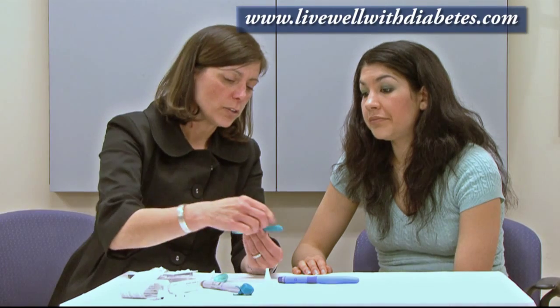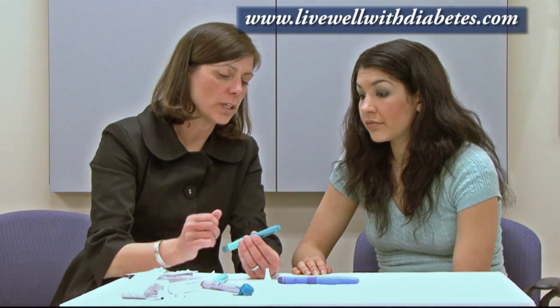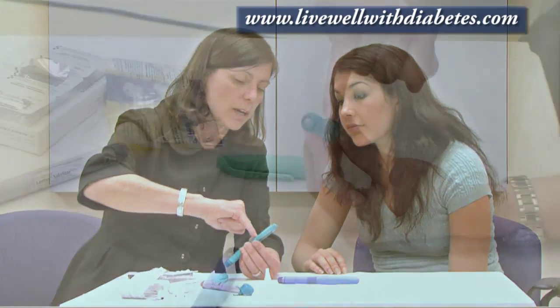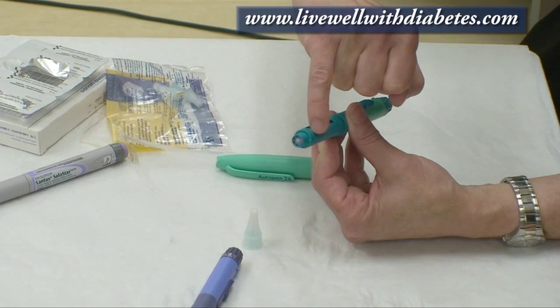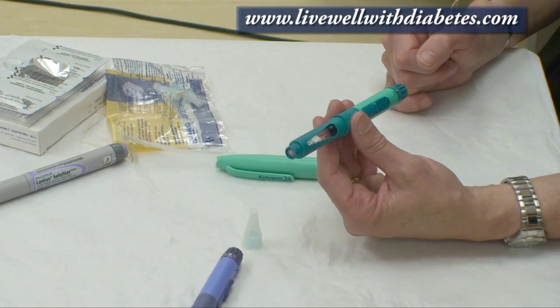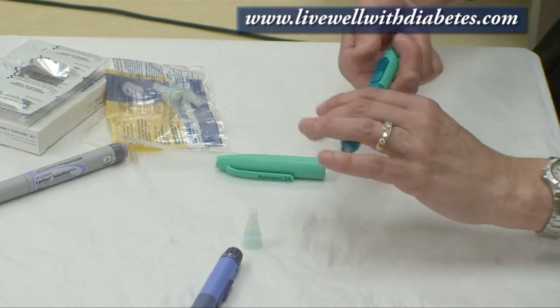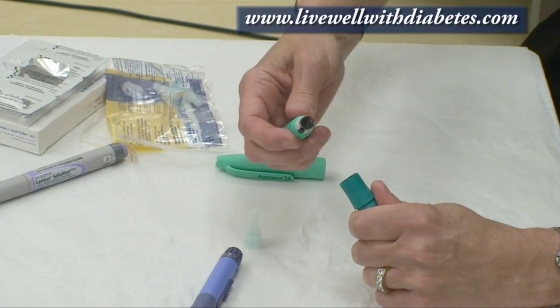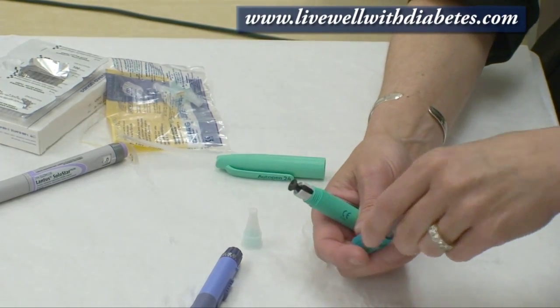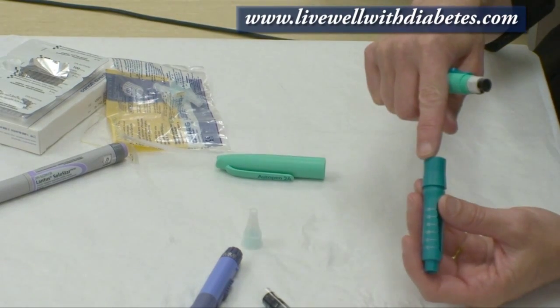Each tube of insulin holds 300 units, and as you use the insulin, that plug is going to get pushed lower and lower until it's empty. When it's empty and you're ready to put a new tube in, you unscrew these two pieces again, the old tube comes out, and you put a new tube in.